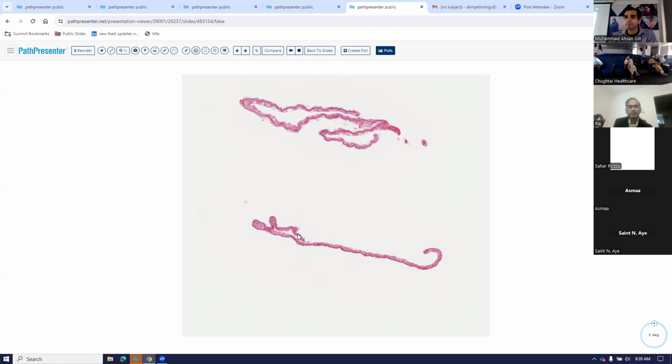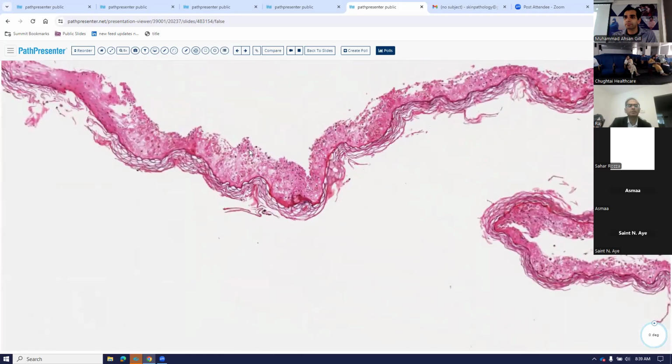So what is the underlying pathophysiology of toxic epidermal necrolysis? The term toxic means it is related to some kind of a drug or something happening within the patient. Epidermal necrolysis means the entire epidermis is necrolytic. When you look at this, you can see the entire epidermis is becoming quite necrotic, or you will see dyskeratosis throughout the epidermis at a much higher level than you normally see in erythema multiforme. Initially it may look like erythema multiforme, but as the skin becomes quite necrotic, the whole skin starts to peel off. So if you get an entire necrotic layer of epidermis, you're going to think about toxic epidermal necrolysis. It will normally split at the level of the dermal epidermal junction, so you see an entire layer of epidermis.